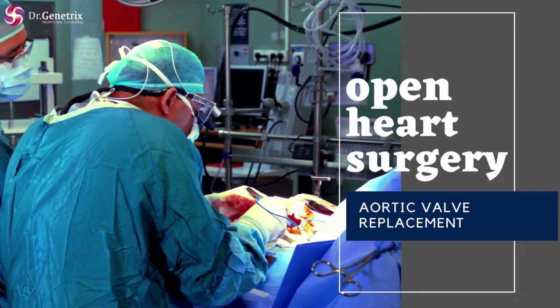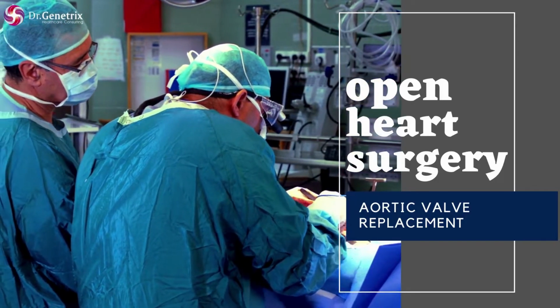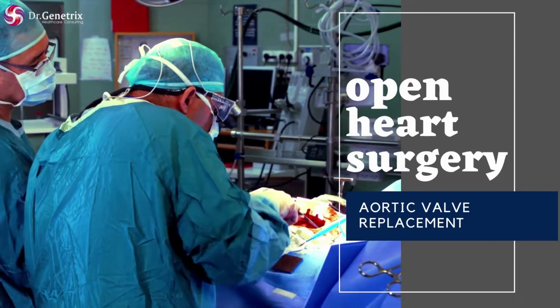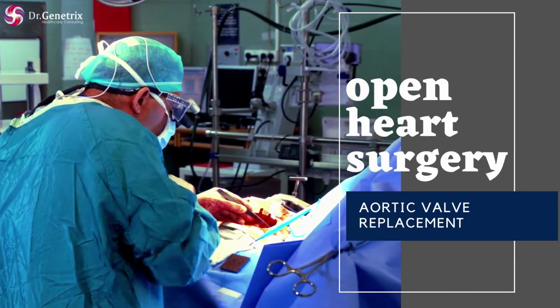If you had been informed that your aortic valve is not functioning properly and an aortic valve replacement is needed, you might like to know the surgery procedure. In this video, we are going to explain the general lines of aortic valve replacement surgery.